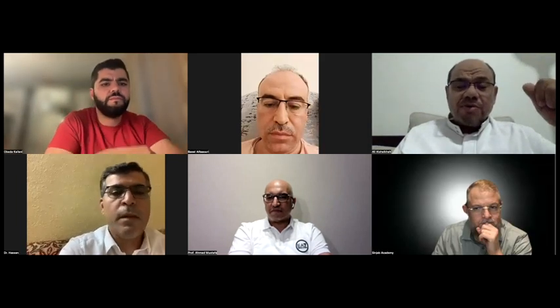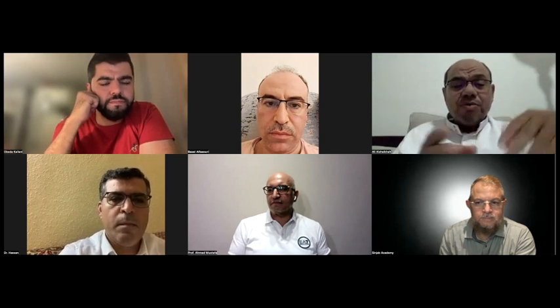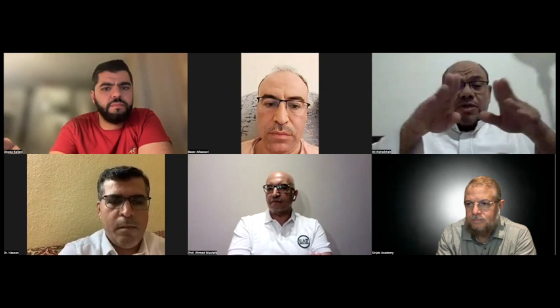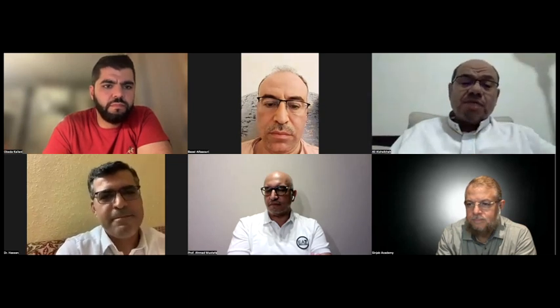Thank you, Hassan. But Dr. Ahmed, Dr. Abayda, sorry, we do not agree with this point only, because with so many tunnels it's difficult to take the tube out at one point. And second, this is the curve of the sclera over the tube. This is the same technique, but I make one tunnel from anterior to posterior, for a long time. I make only 1.5 for the crescent and go posteriorly. The tunnel does not need to be so wide, and you don't need so much crossing, because you need the sclera over the tube to go smoothly to the side. If you make it so small, the sclera covers directly over the tube and may make the tube more prominent under the sclera, and in this type we have more risk for exposure. If you have it more smooth, the risk for exposure, I think, will be less.